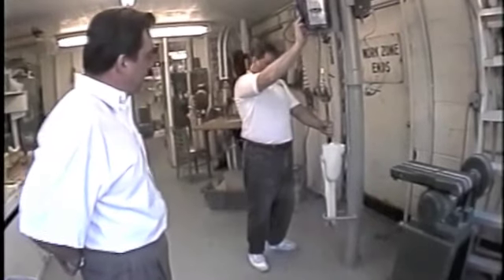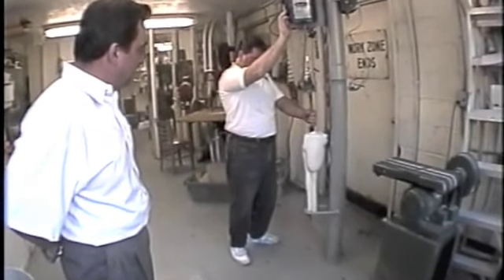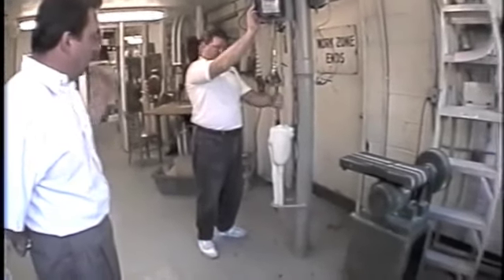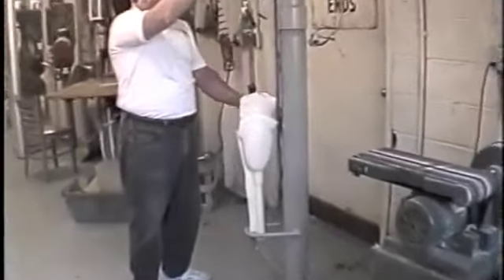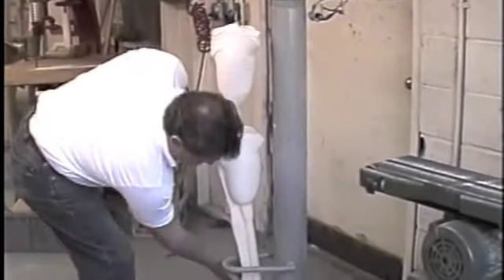So take it a little bit and stop. Okay, hold it. Now hit it again, just a tiny bit. You got it. See it pulling out? Now you can go all the way. Very good.